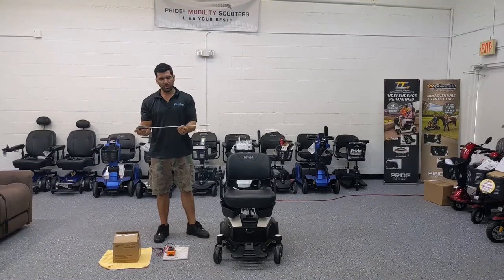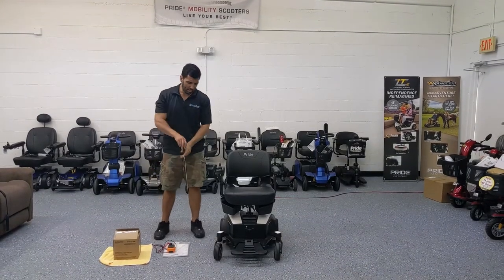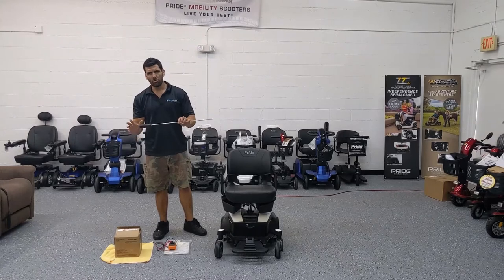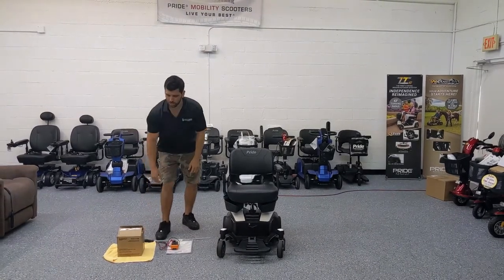You will want a long screwdriver. It doesn't need to be this long, but I like it because I don't have to bend down. You can use one that's about eight inches or above. It's a Phillips head screwdriver.